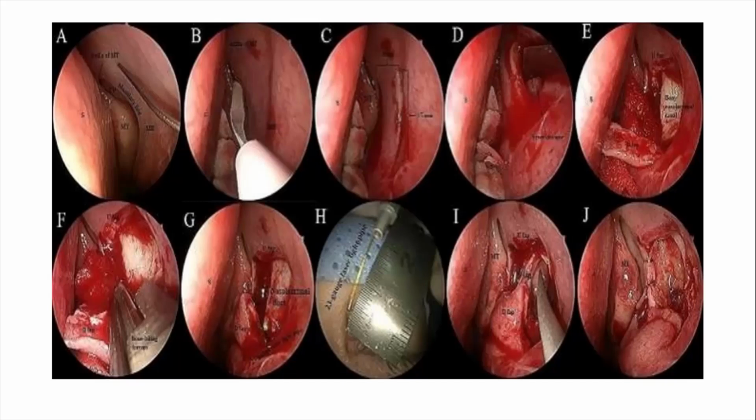So the infiltration is here, and the incision is like this. Then you make the flap. Here you can see this is part of the bone. This is not the sac, it's the nasolacrimal duct. This punch is exactly in the duct area. So you have to open the lacrimal bone proper to expose the fundus. Only then will you reach this height and expose the sac. This is a complete exposure of the lacrimal bone and sac, and finally this is the uppermost exposure, where you still see the entire sac.